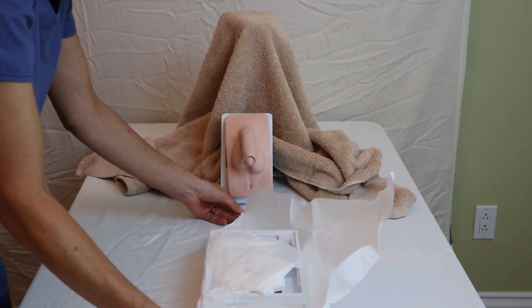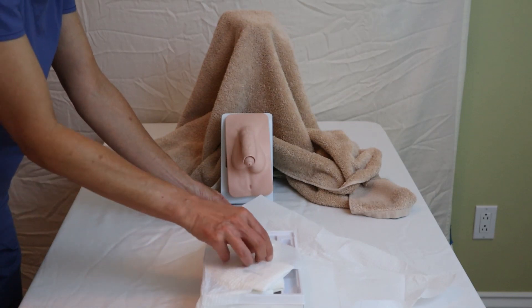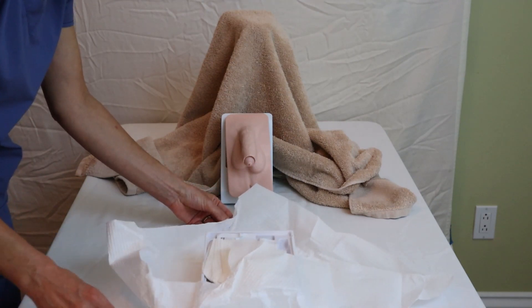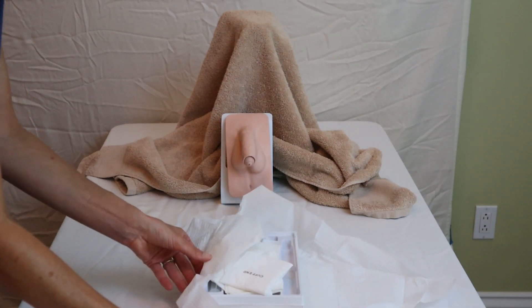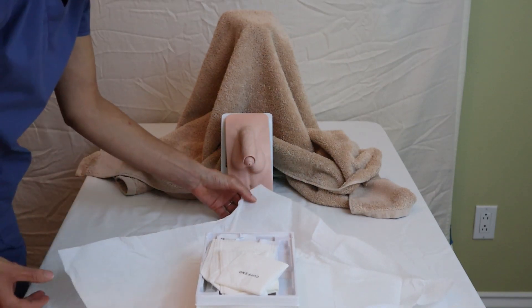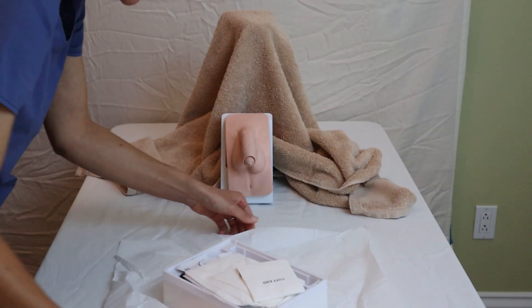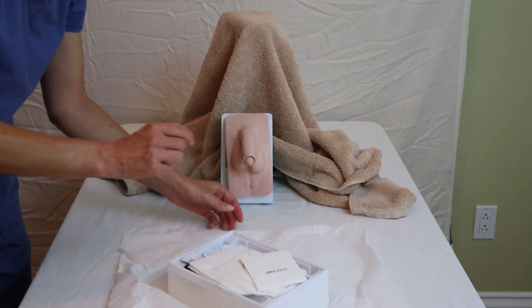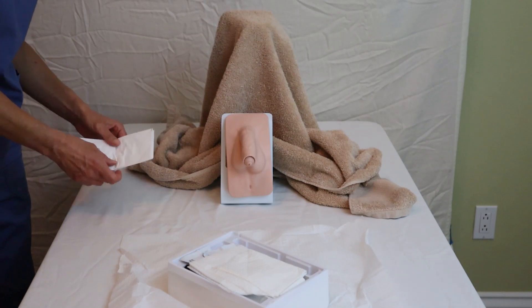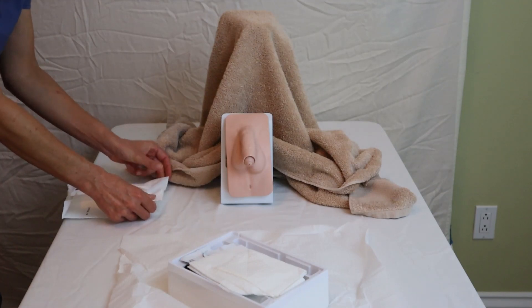Remember that one inch of the sterile field perimeter I can touch, but no more than that. When it comes to the last flap, I want to make sure I just grab it on the outside that will eventually sit on the bed. This one is a little stubborn, which can definitely happen, so you just need to wiggle it around so that it stays nicely open. I then like to place it this way, and right away I can see that my sterile gloves are on top, so I'll take those and put them aside from my sterile field. Remember not to turn your back on your sterile field.